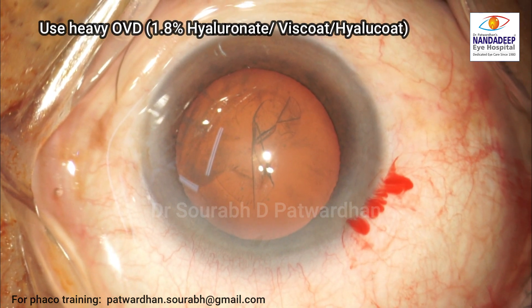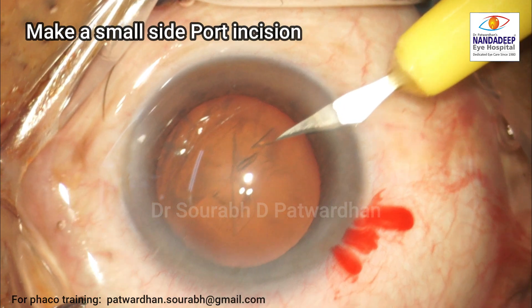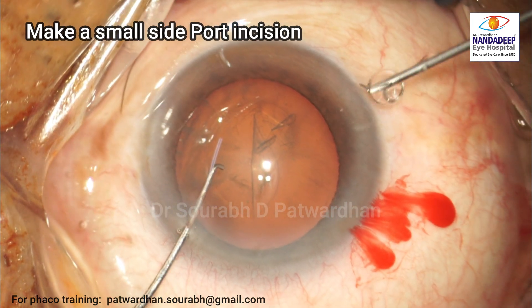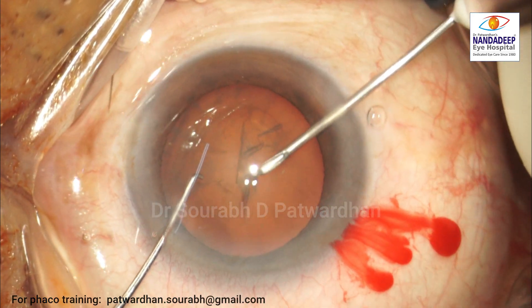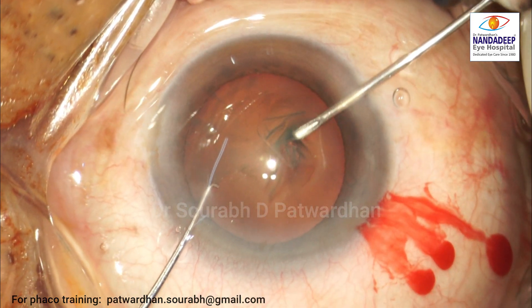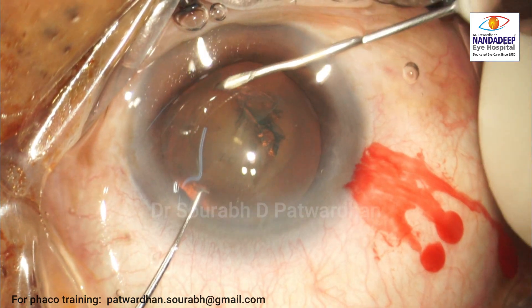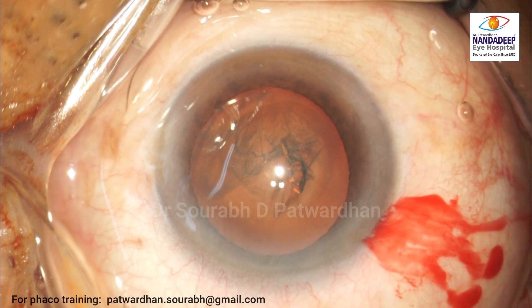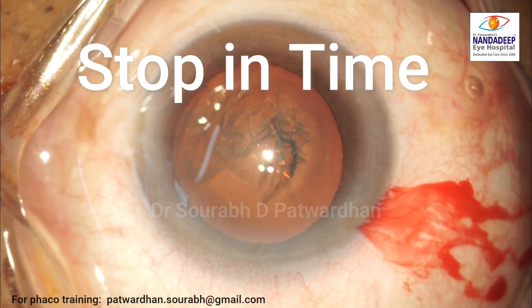Now, how to tackle this particular situation? Use a heavy OVD like 1.8% hyaluronate, or Viscoat, or Healon5 to press the anterior capsule down. Make a small side port incision because you don't want Viscoat to leak out from here. And then proceed with capsulorhexis from the side port. Once I do these two steps, it becomes much more controlled and I know I am going to complete this capsulorhexis without any extension. It is very important that we prevent this by reducing the intraorbital pressure before we enter the globe.